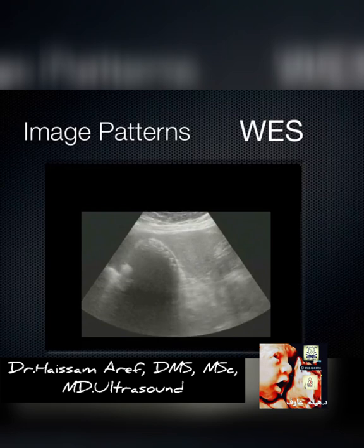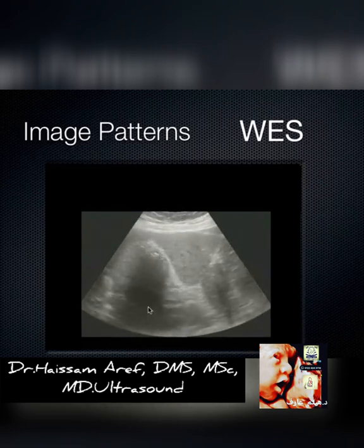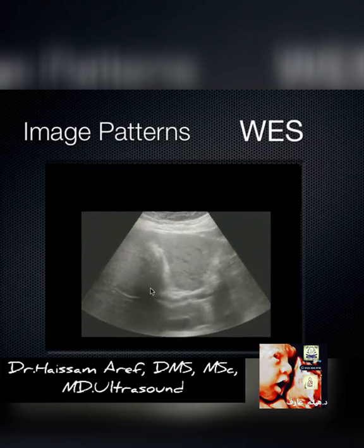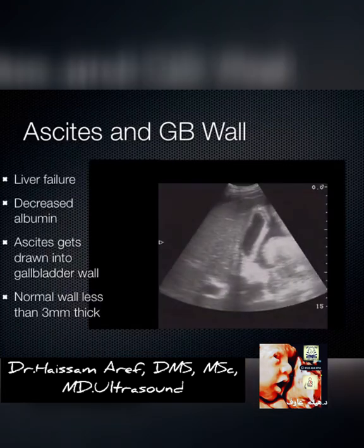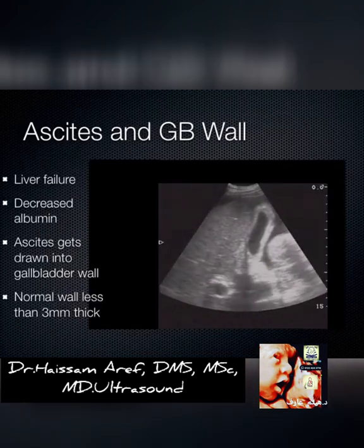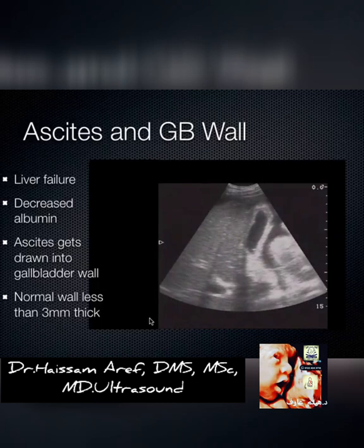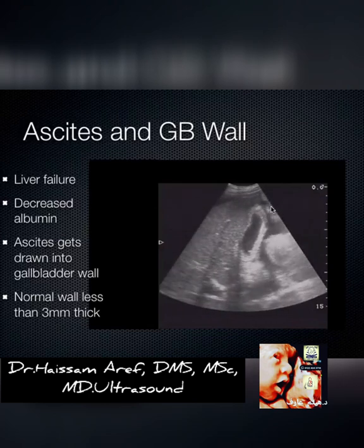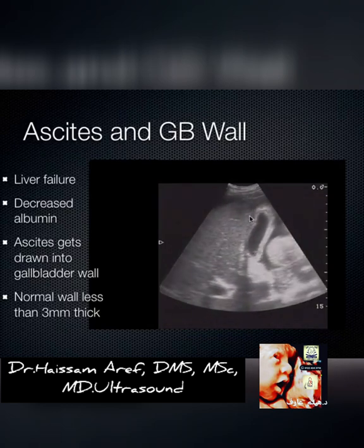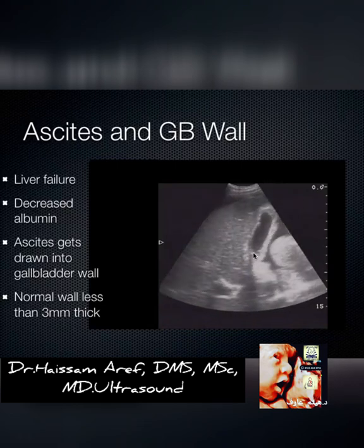This is actually a true WES sign — a contracted gallbladder around a whole bunch of stones, all casting one big fat shadow out of the liver. When you have ascites, fluid leaches into the gallbladder wall and almost always patients with ascites have thickened gallbladder walls. A normal gallbladder wall should be less than 3 millimeters.